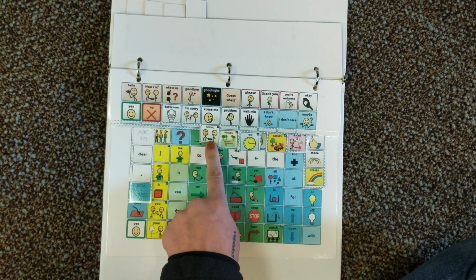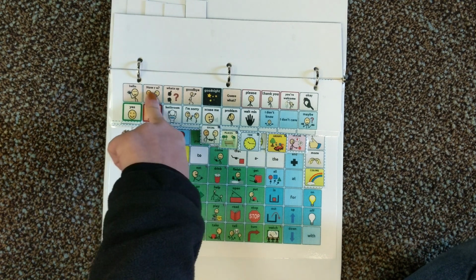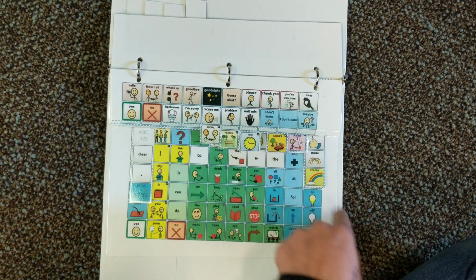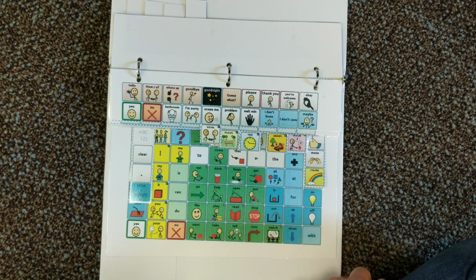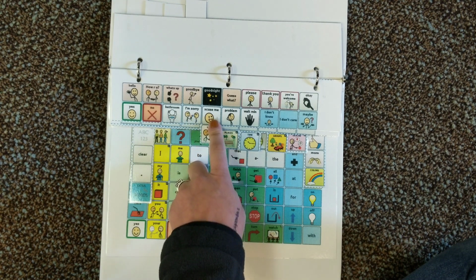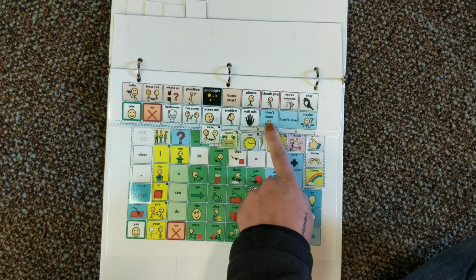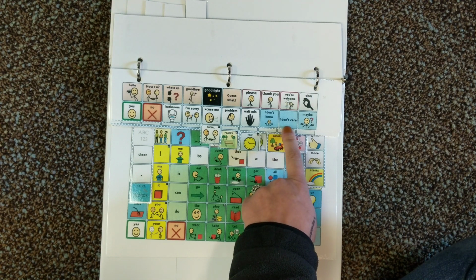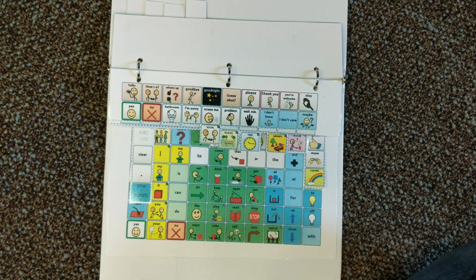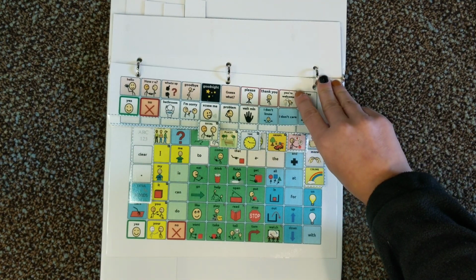And then there's the social tab. So this includes like questions, hello, how are you, goodbye, greetings, salutations, manner words like I'm sorry, excuse me, you're welcome. And then it gives them some things like I don't know, or I don't care, maybe. It's really important to give our kiddos the voice. Like if they want to say I don't care, they should be able to say that.